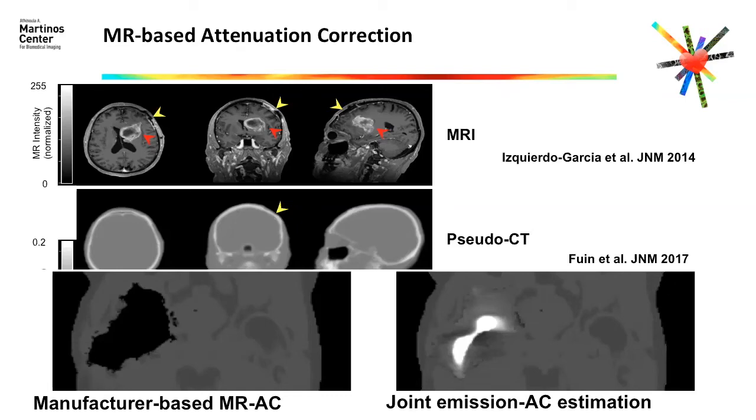And he created a method using some MR techniques that are slightly less affected by the artifacts of the implants to recreate the actual attenuation correction of the implant, which is huge, by the way, because they are normally titanium, which is very electron dense. That means they attenuate a lot, much higher attenuation, so they will induce a lot of bias in PET quantification if we don't correct properly for this.